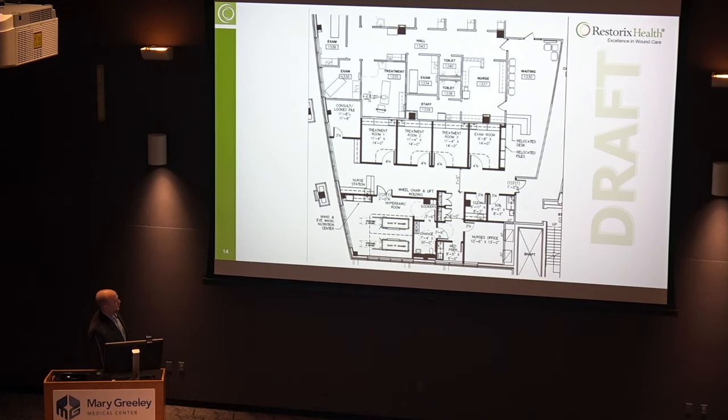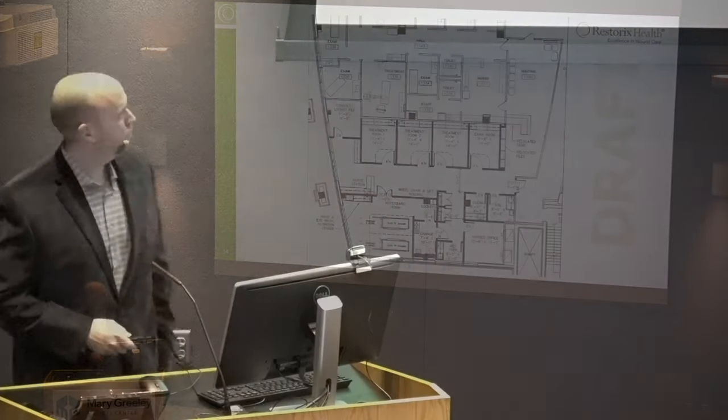Stretchers come out of the chamber. Patient gets on the stretcher and it slides into the chamber, and you have a technician or a staff member who pretty much lives in this room tending to the patients. So really kind of a neat thing once you see that center take shape. And that pretty much takes us through to questions.